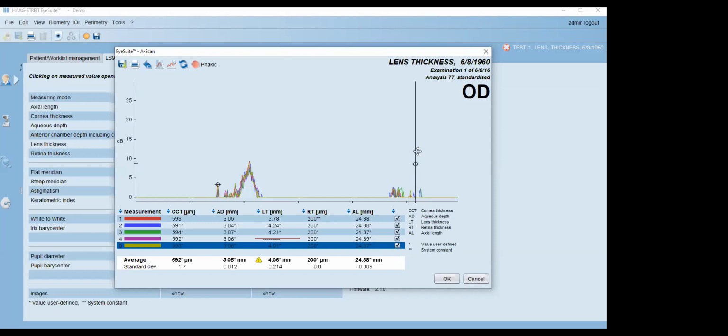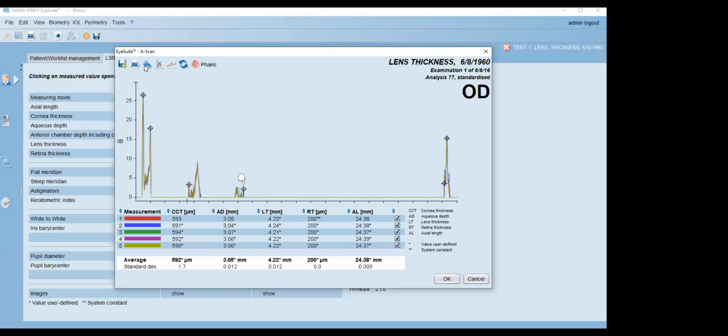And then when we click, hold, and drag, we can move the gate out of the way using our line to dissect the very last spike of multiple colors, and a mouse click release to drop it on the peak. Now we have a finger pointing down over the icon that was moved, and our measurement value changed.